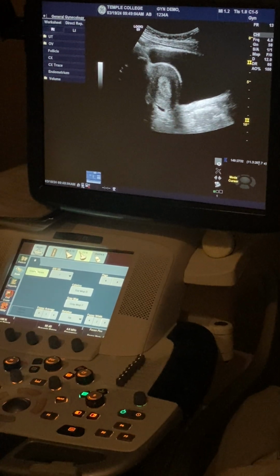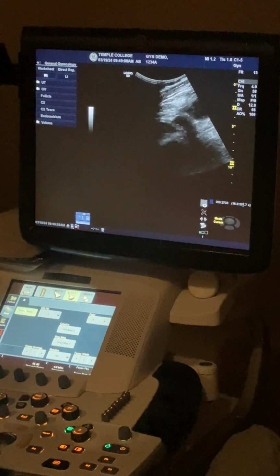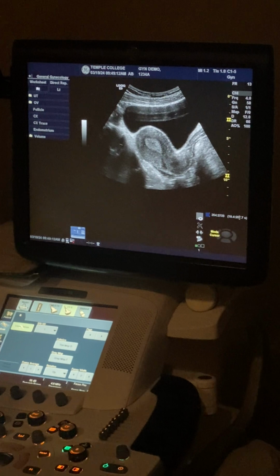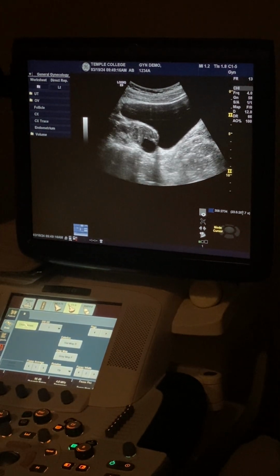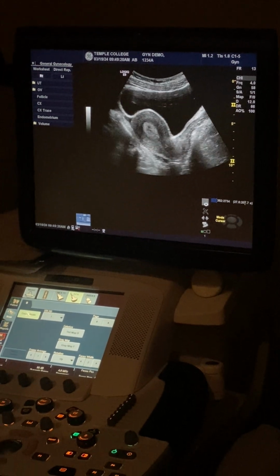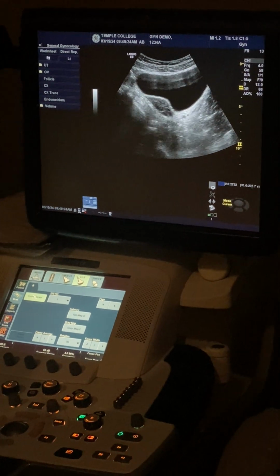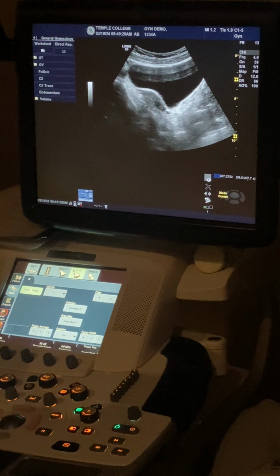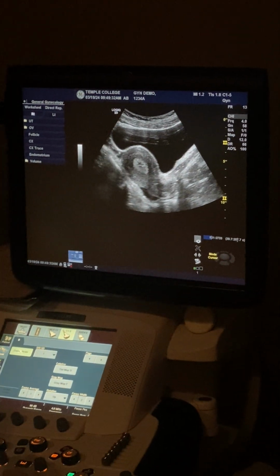It's not terrible, but can we do better? We can always do better. So what I'm doing is really sharply heel-toeing it, and look at all of the bladder now I put over the uterus. And I can go all the way to the right and see her nice little ovulating ovary there. And then sweep through, a little free fluid in the cul-de-sac, that's fine. And see her other little gorgeous ovary also as a follicle over here. Do you guys see how effortless that was? Saw everything.